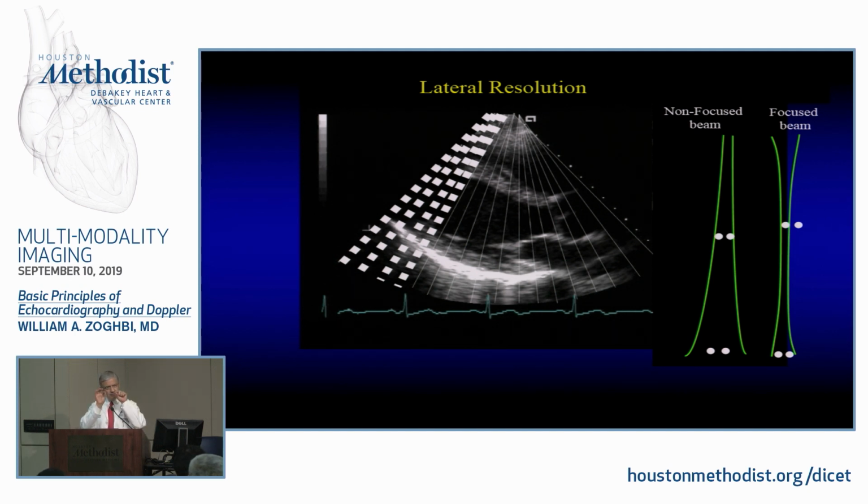In the phantom where you test, there are pins, and you could see how much deformation these pins have, particularly in the lateral resolution. It's not a pin seen, it usually is a pin with a little spread around it. It doesn't look like a pin. And this lateral resolution depends on the width of each one of these scan lines going down.